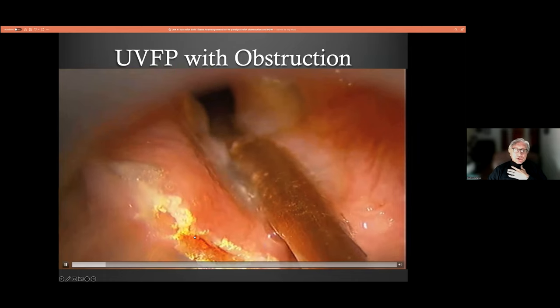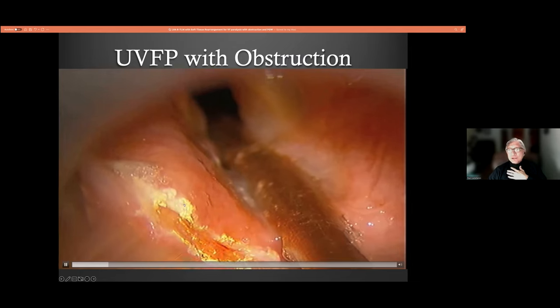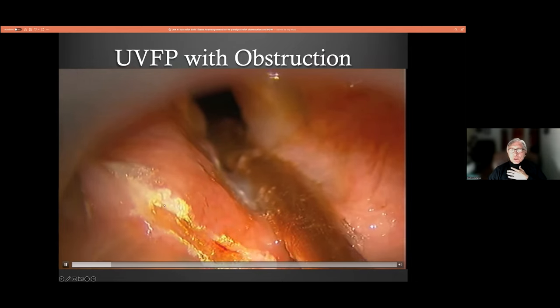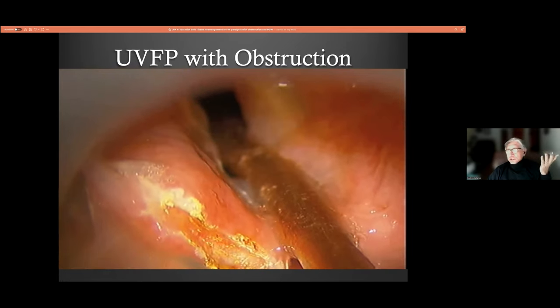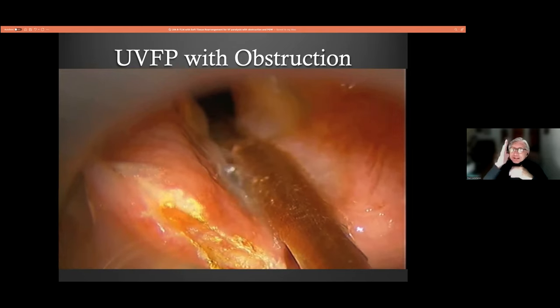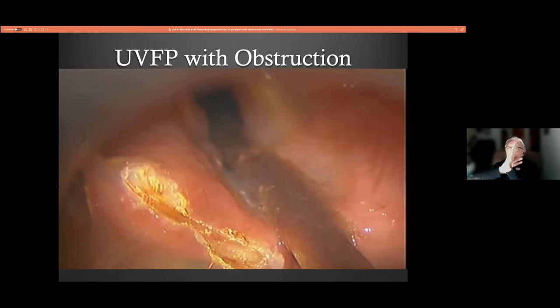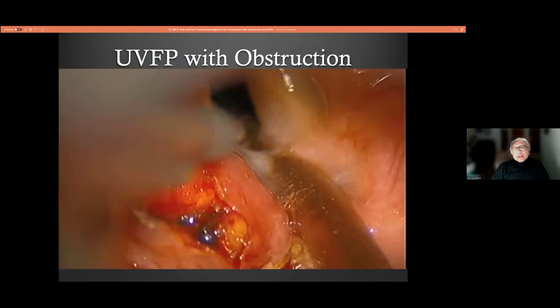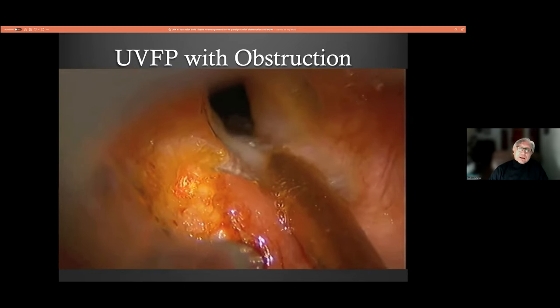But what I'm doing basically is using the scanning laser to open up a flap of mucosa here overlying the prolapsing arytenoid tower. And I was going to basically amputate all this tissue, close the wound up, let her heal, and bring her back another day for a medialization or even just an injection laryngoplasty if there was enough room. Oftentimes, the cord itself that's paralyzed, in her case, this side, has come across so far in the midline that it's not just a prolapsing arytenoid top or tower, it is an encroachment through the entirety of the airway at the level of the larynx.